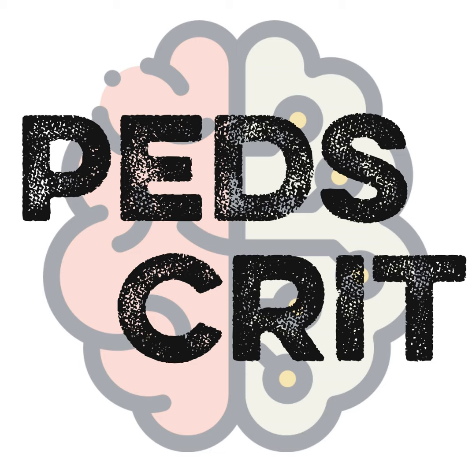Important things to know about the ACT is there can be some inter-rater variability within the test itself. It's also affected by platelets and hemodilution, which we can see pretty frequently, especially when we're going on ECMO. And so that's just important to know when you're getting these tests, is just try to think about it in the context of what's going on in the patient. But I think as a trend, the ACT is a helpful test.